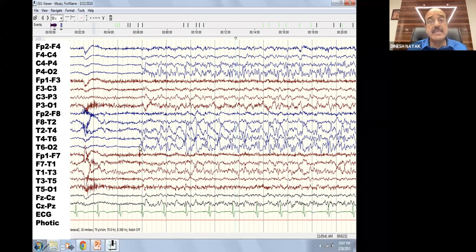The frequency has become faster, and the periodicity has disappeared. Now it has become almost continuous, and it is evolving. And now it has spread to the opposite hemisphere also. So this is what is called PLEDS plus becoming a seizure, electrographic, then clinical. So that is what it is.